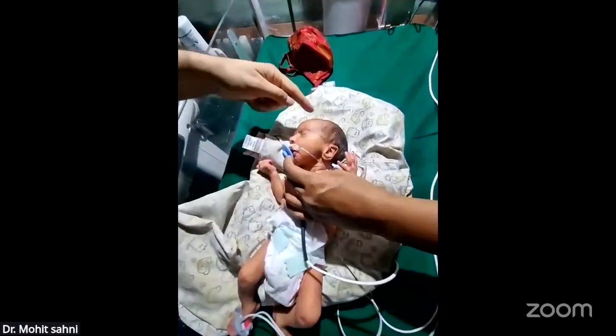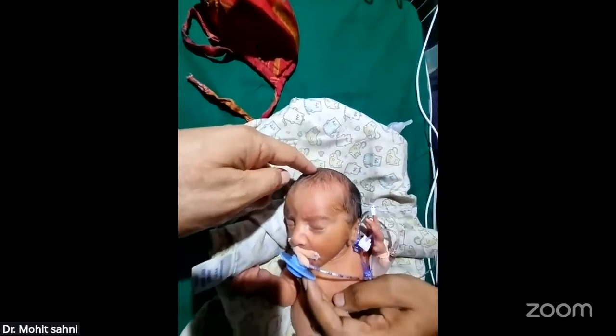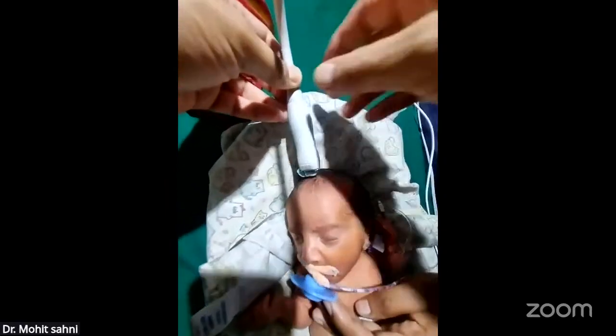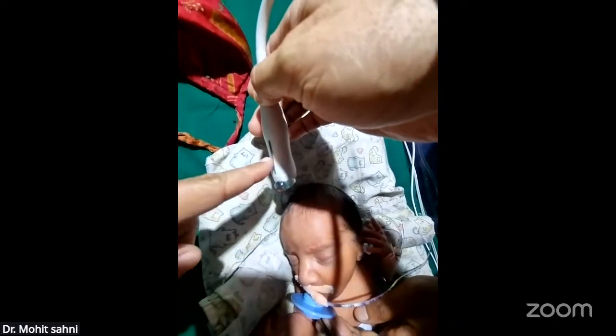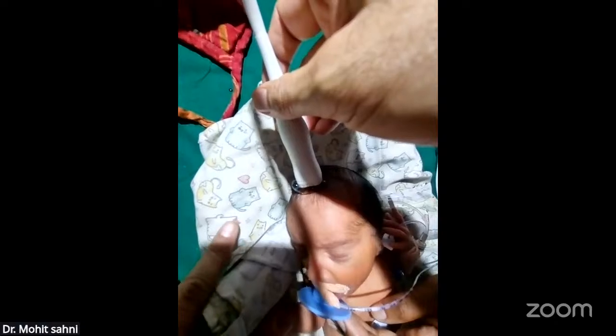So now here, this is the AF, anterior fontanelle. When we put the probe in the AF, we will keep this probe marker at 9 o'clock, that is on the right side of the baby.